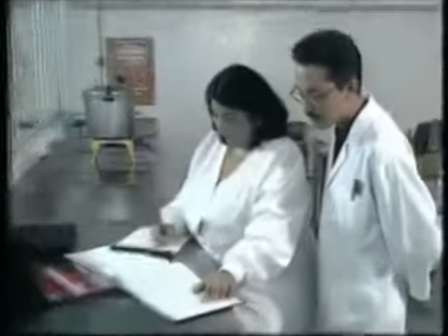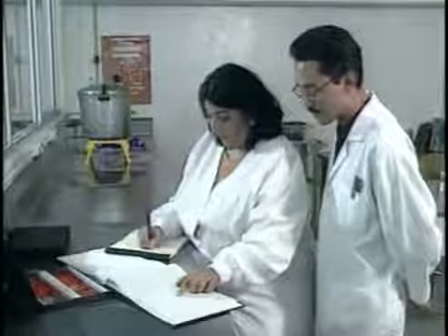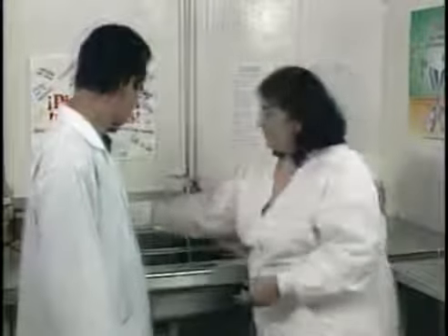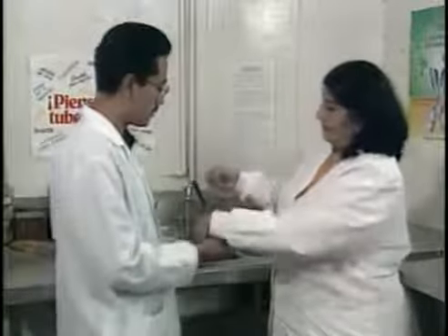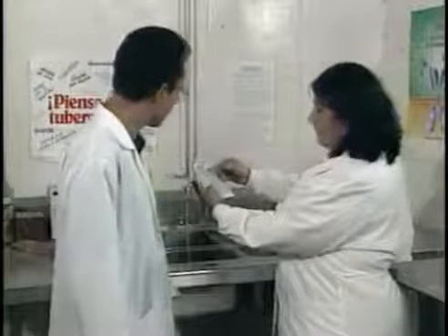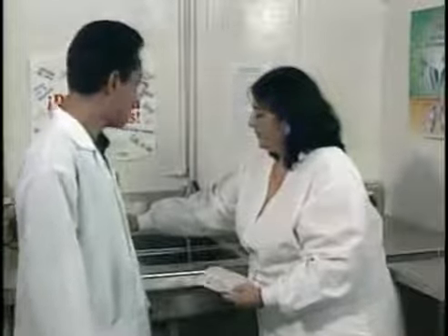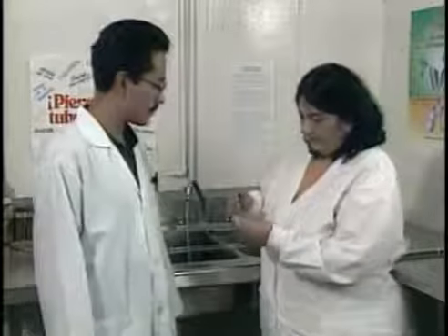Quality control should be routinely performed in the laboratory to ensure reliability as well as reproducibility of results. Perform QC on each new batch of stain. Observe these results before reading patient slides. This important step will verify correct staining procedure and microscope function. When controls are not demonstrating proper staining, determine the cause and correct it.